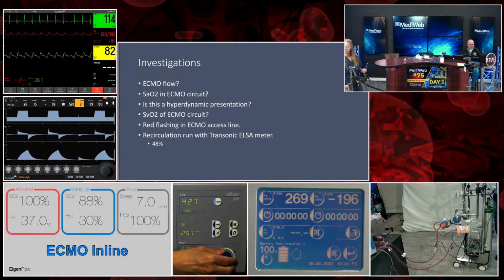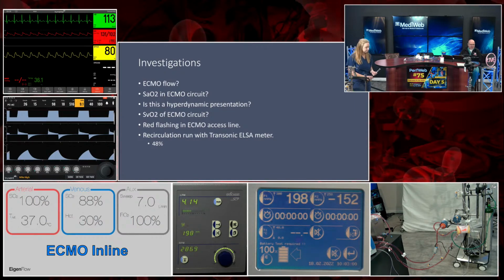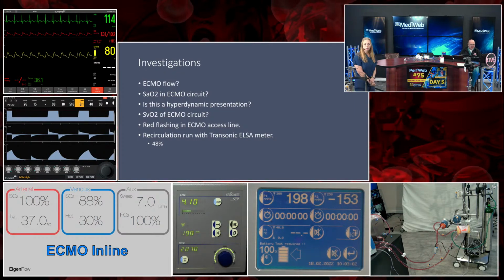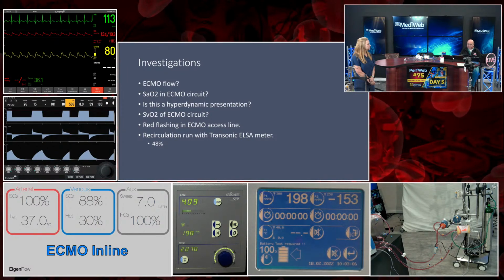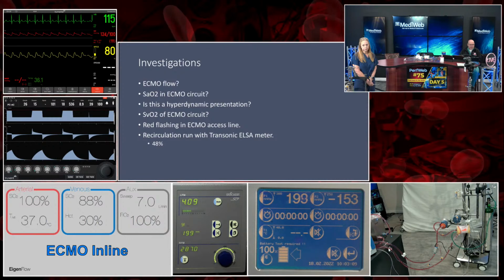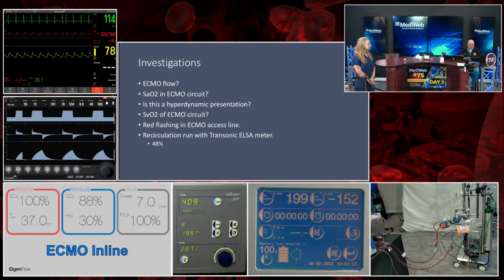So let's look at the investigations. ECMO flow, we tried that to no avail. SaO2 of the ECMO circuit is 100%. We don't have a problem. Is this a hyperdynamic presentation? Doesn't appear to be. SVO2 of the ECMO circuit has gone up. That is a red flag.